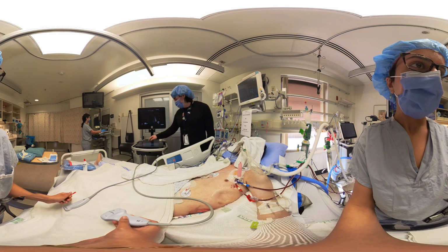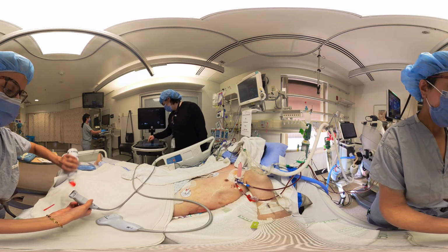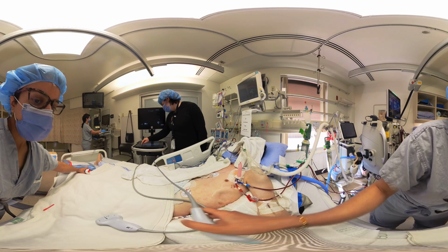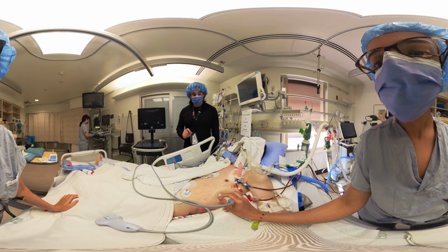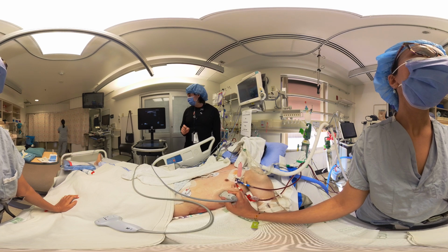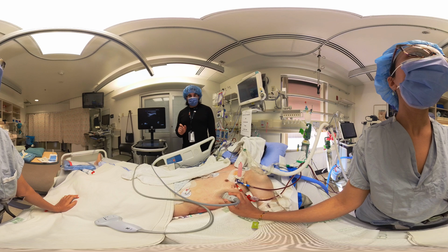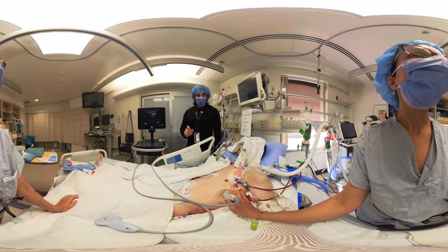So let's swap out probes. And we're going to look for blood vessels. So we're going to apply the probe with the probe marker towards the head, and we're going to look across the vascular space and look for any obvious blood vessels in this area. Generally in this area, the neurovascular bundle, the arteries and veins in the intercostal space, will be below the rib. So we aim above the rib to prevent inadvertent puncture.